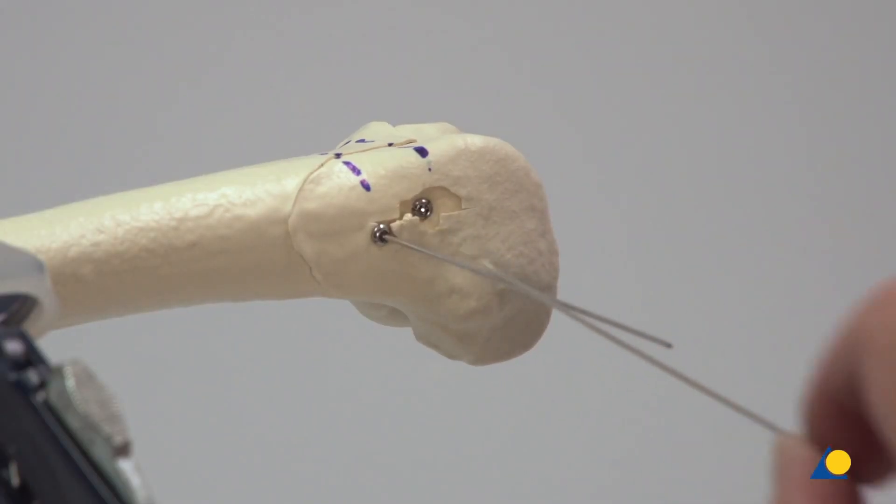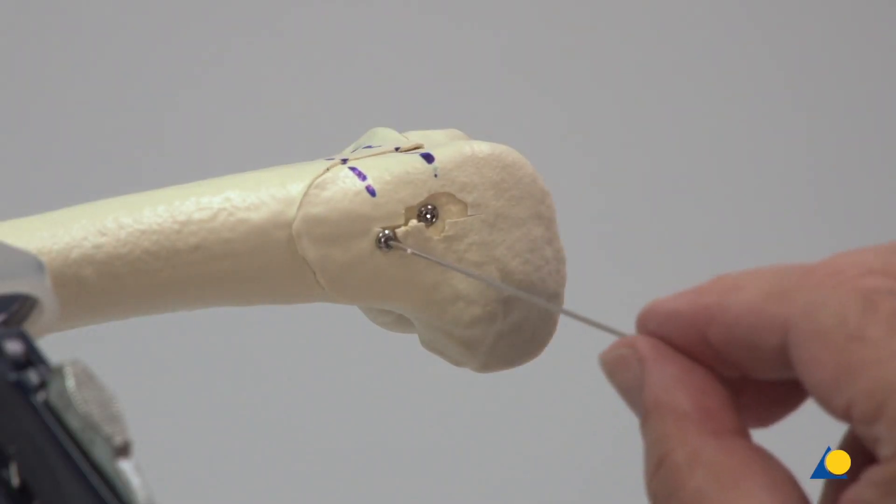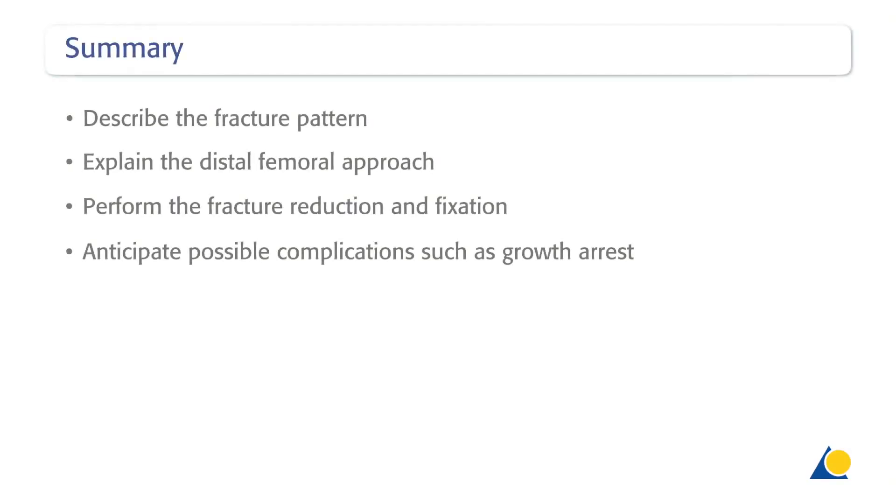The fracture fixation is achieved and the guide wires are removed. You should now be able to describe the fracture pattern, explain the distal femoral approach, perform the fracture reduction and fixation, and anticipate possible complications such as growth arrest.